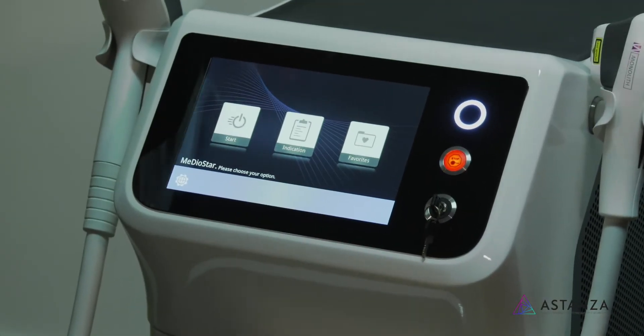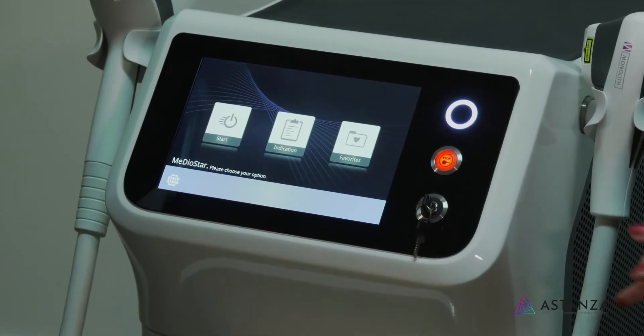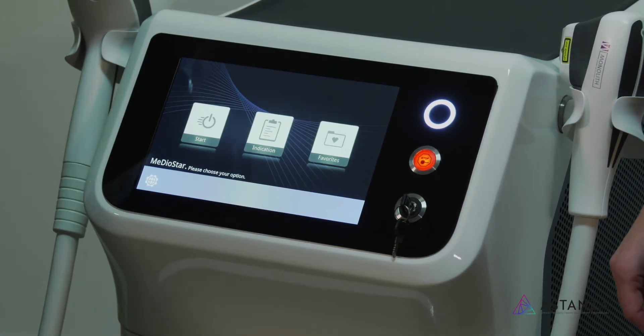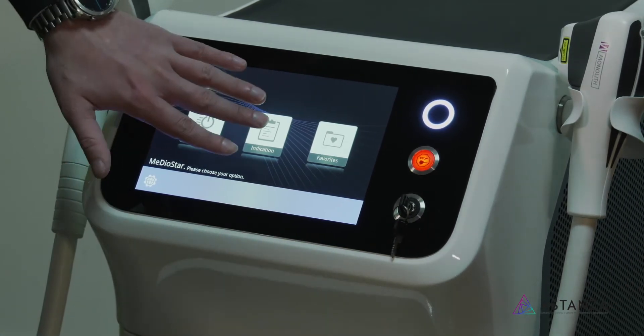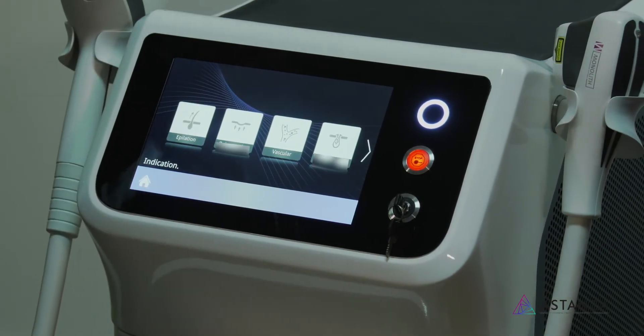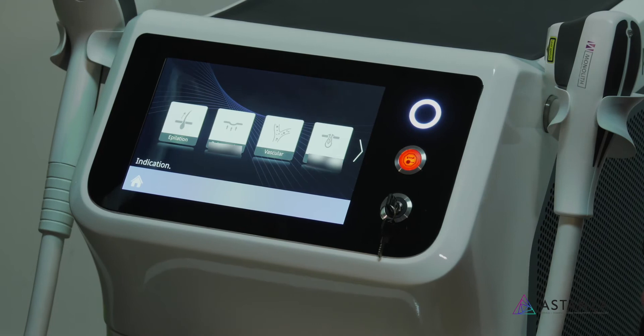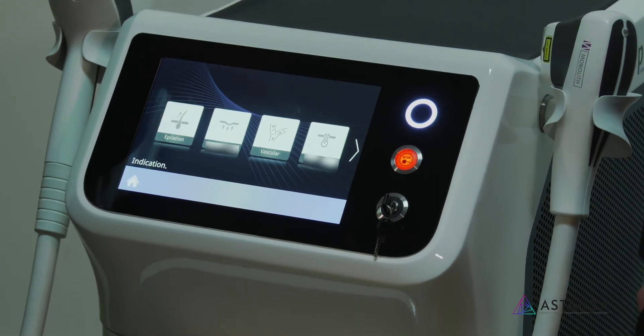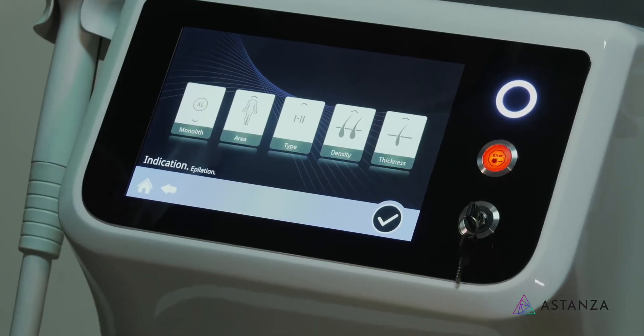Mediostar is one of my favorite devices, especially for people who are long-time in the industry or brand new to laser hair removal. The indications are wonderful — very easy to use and very dynamic. They're pretty much appropriate for the skin types and the position on the body you're treating. So let's go to epilation.